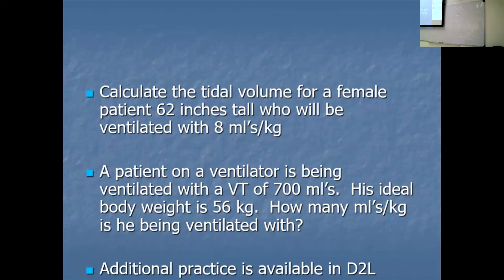So if you know the tidal volume, you divide by their ideal body weight, and that's going to give you mLs per kilogram. Let me put that in the chat. Leave that one like a decimal? Yes, you can.